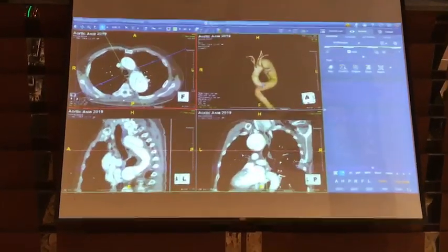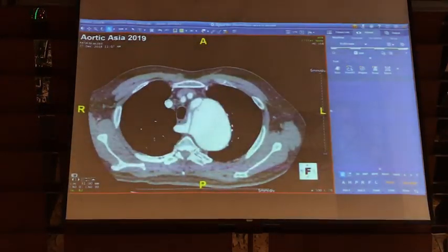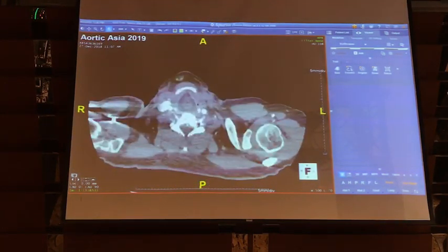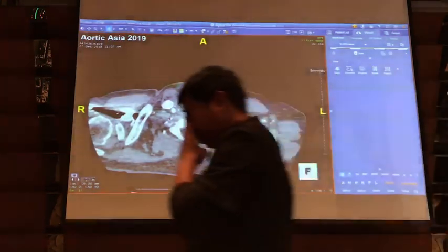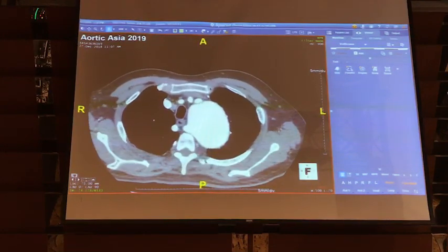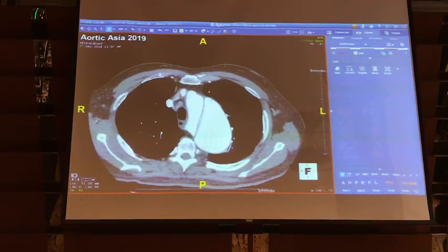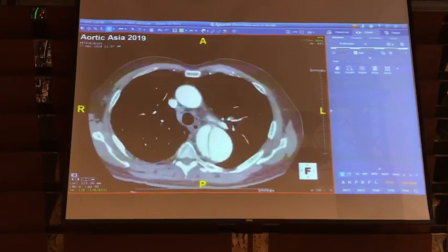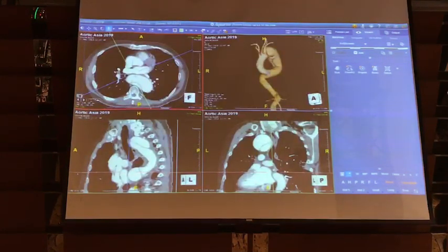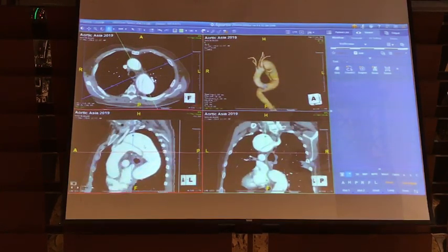You can see a main tear, which is not quite high. There's a second tear very close to the origin of the aberrant subclavian artery. The lumen is very narrow. If you trust me, the left vertebral artery is dominant compared to the right. They both arise from the subclavians. If you come down from the top, that's the aneurysm, that is the aberrant subclavian artery, the dissection all the way to the origin of the left subclavian artery, and that's the main tear, and then that's the bottom, which is not an issue.